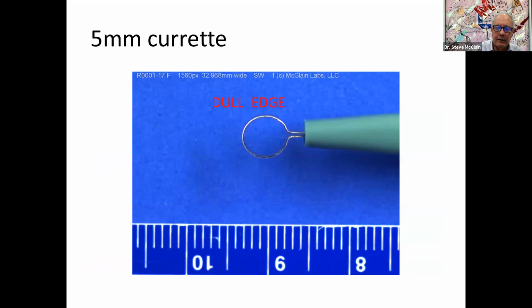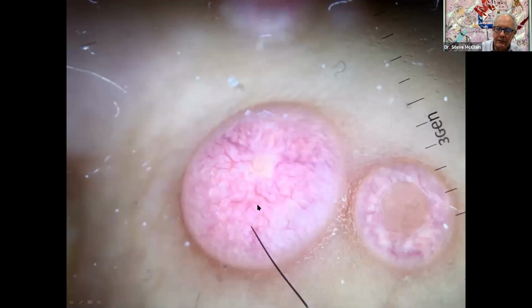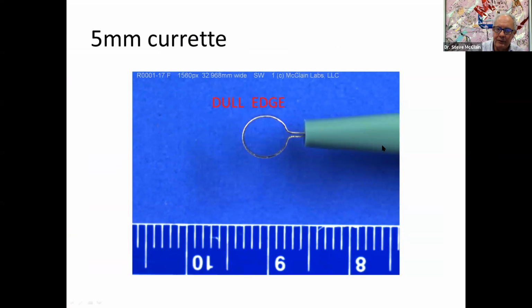Okay. Let's see. The curette. This is my favorite tool. Pathologists are idiot surgeons. At least I am. This tool has two edges. There's a sharp edge and a dull edge. The way you can tell the difference is that the dull edge has a crosshatch. You'll feel it. You can tell. You either use it with your thumb or your forefinger, and you hold it like a pencil.